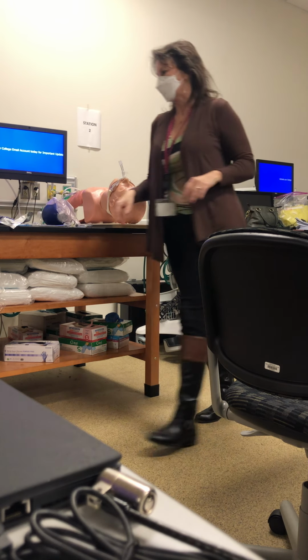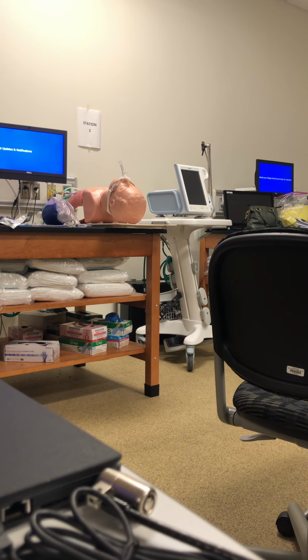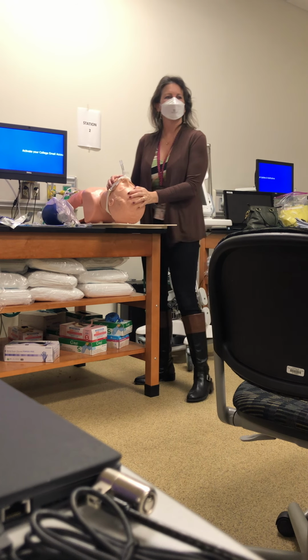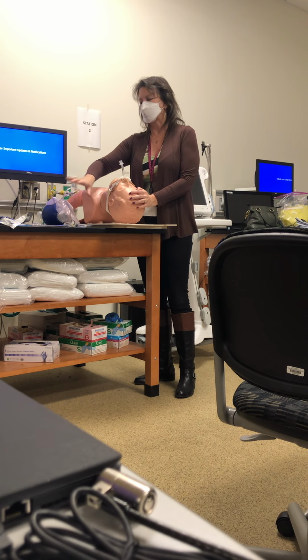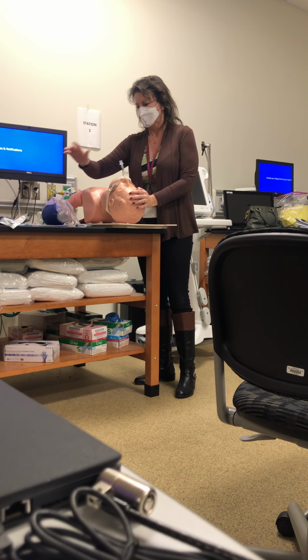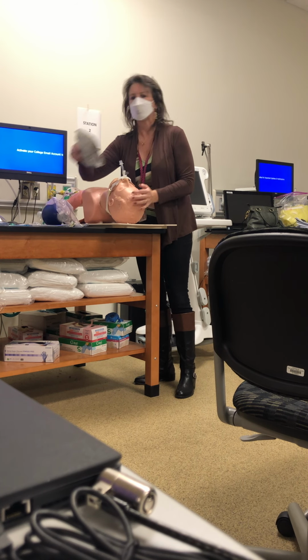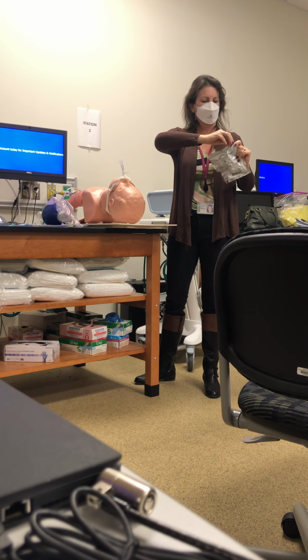And we never leave the lights on because they get hot, especially in the neonatal world, they'll burn the babies. Okay, so what's the next thing we want to do? We're getting ready to intubate this guy. So he's got a non-rebreather on right now. Okay? All right, so we've got everything. We want to get all of our equipment ready. All right? We have the stylet in here. We have the syringe here. We have an easy cap. Okay? So we're going to open up our easy cap to have it ready.